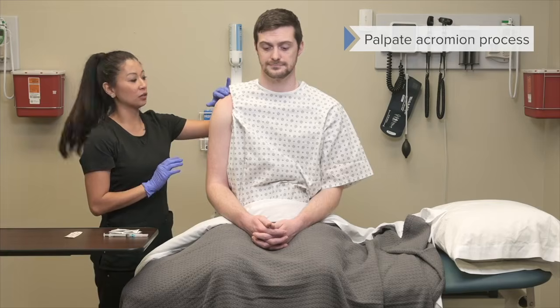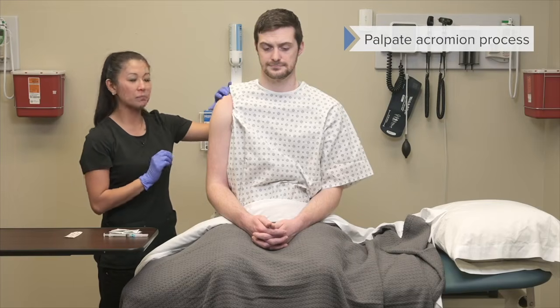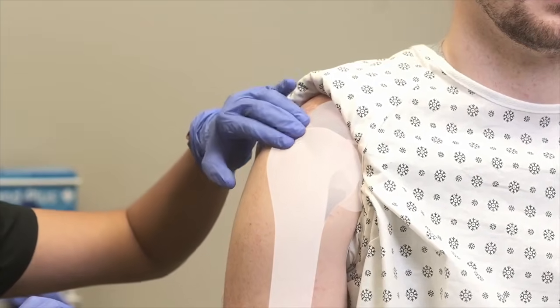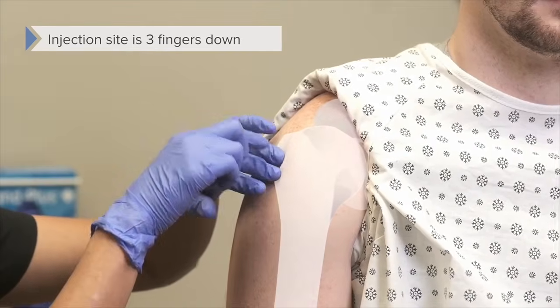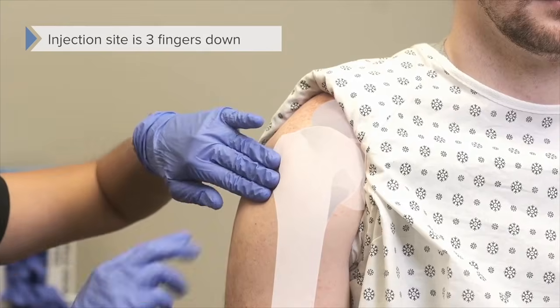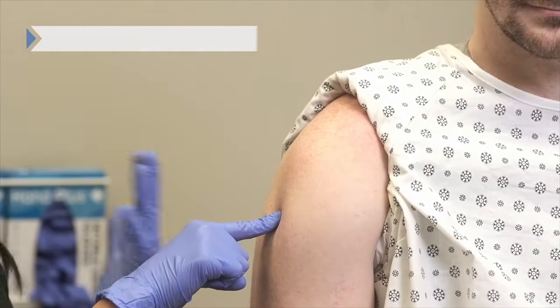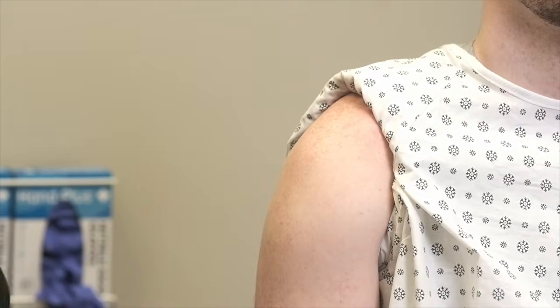First, we're going to take our fingers and find our patient's acromion process. That's going to feel like the really bony part of the top of the patient's shoulder. I like to creep my fingers all the way down to where I can find the edge of the acromion process with about my third finger. Go about 3 finger widths down, and then right here is where I'm going to inject. The other thing you can do is visualize a triangle of the deltoid, and you can go anywhere inside that triangle. All right, so now that I found where I'm going, I'm going to clean that injection site.